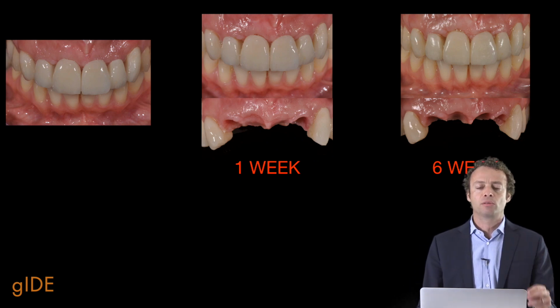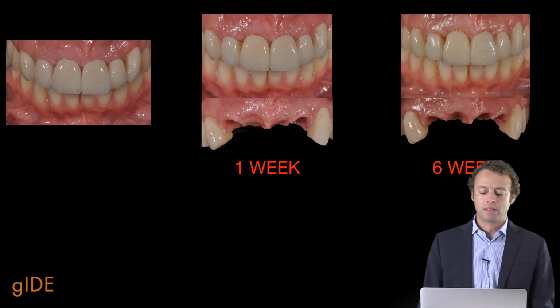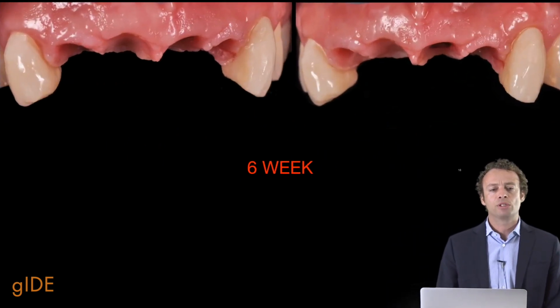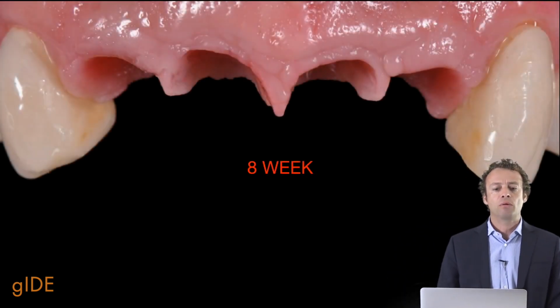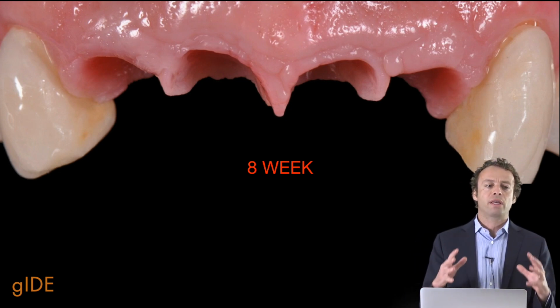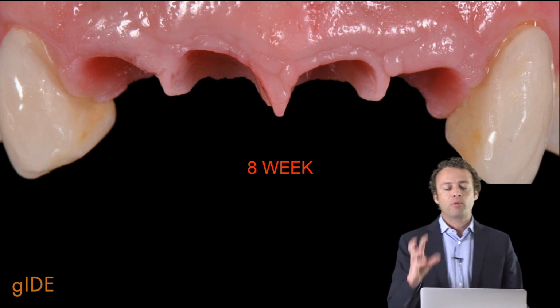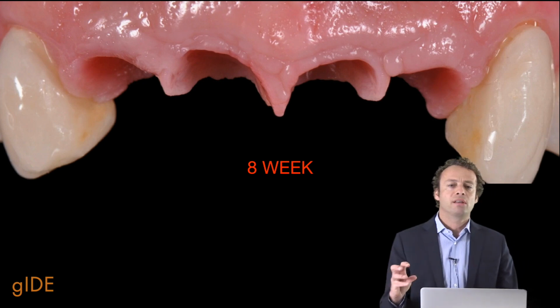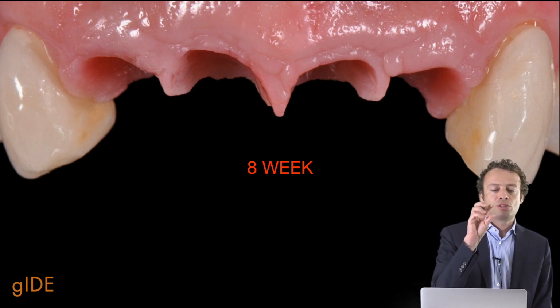And it's really important to pay attention to each detail in this kind of prosthetic approach. Here in detail we can see how the soft tissues are after 6 weeks, and here we can see how the soft tissues are after 8 weeks. So we are able to recreate a good scalloped profile with a good pseudopapilla. But the problem of these soft tissues is that this morphology is created thanks to the temporary that maintains the position of these soft tissues.